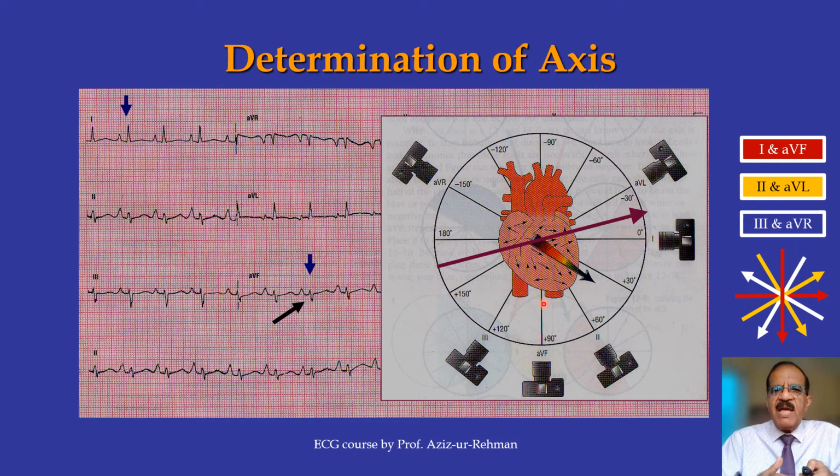This is how this exercise goes. We're going to have one more exercise, and then I will demonstrate another method. There are actually two methods. Maybe this one is, I think, philosophically better, so I demonstrated this one first. The other one may be easier for you, so bear with me, and I'm going to show you another method which is easier. So let's repeat this one in another ECG to make the concept better.